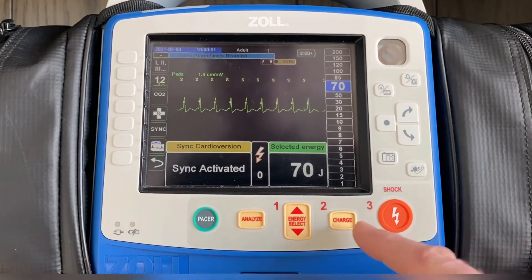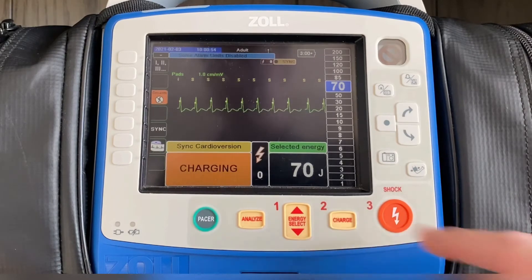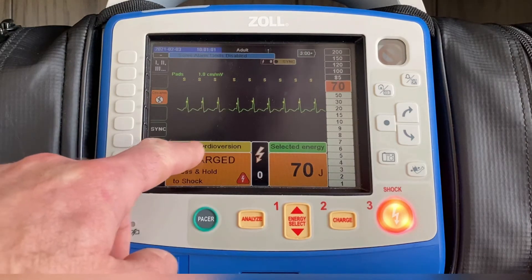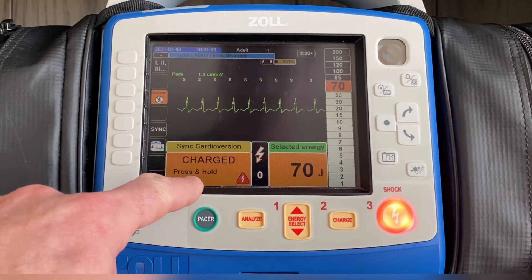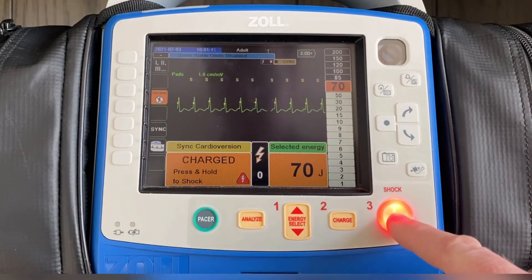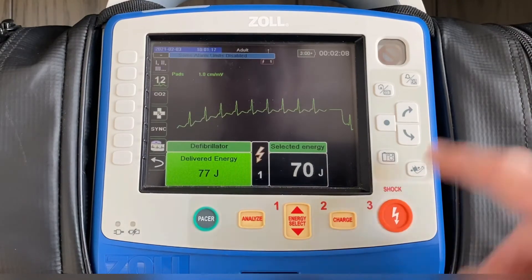You're then going to press the charge button to charge the capacitor to 70 joules. Your last visual indicator is that the monitor now says "sync cardioversion, press and hold to shock." So unlike a normal defibrillation where you can just tap the button to deliver the energy, you're going to hit and hold that button until the energy is delivered at the peak of the R wave, by way of that S indicator above the QRS complex.